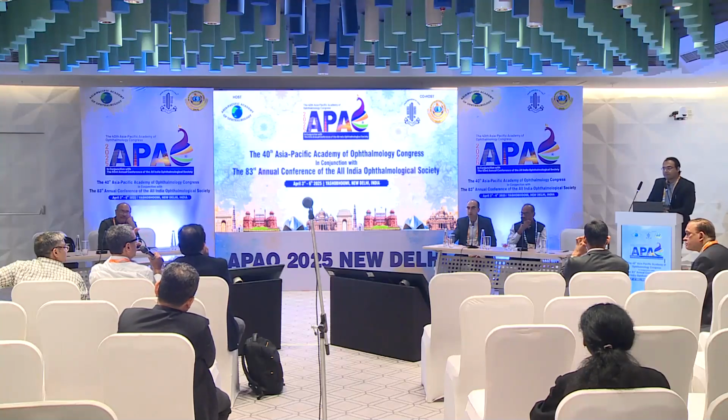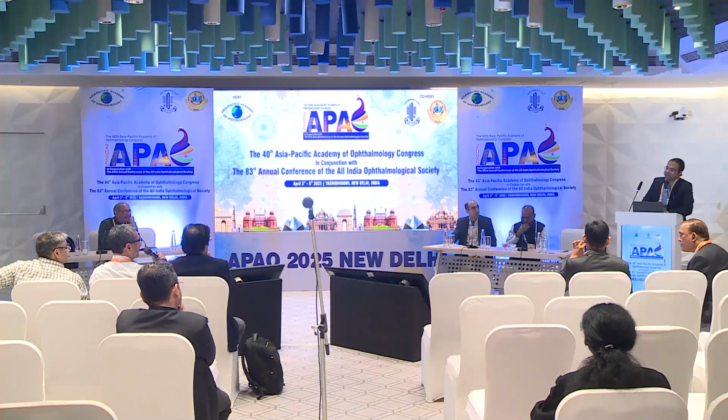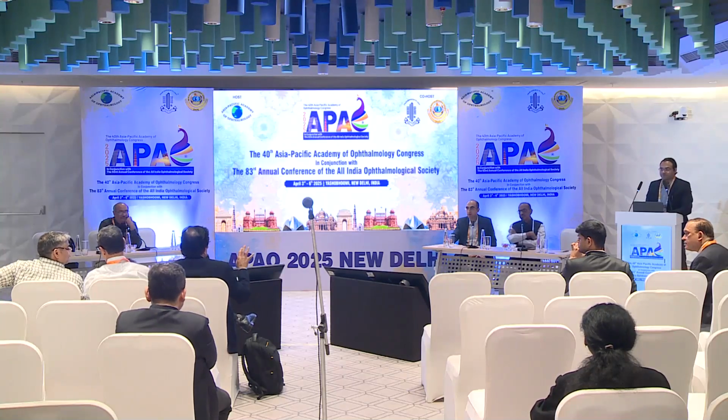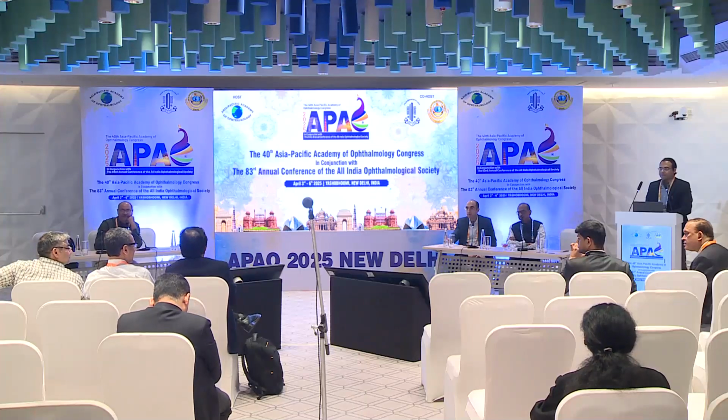Still, you have to treat a clinical OCT which is showing IRF, SRF or some fluid in one of the components. So am I right? In all my presentations, sir, I say that yes, I am talking about this modality, but you need to treat the patient and not the investigation. Great, great. I'm just throwing a question for the entire panel.